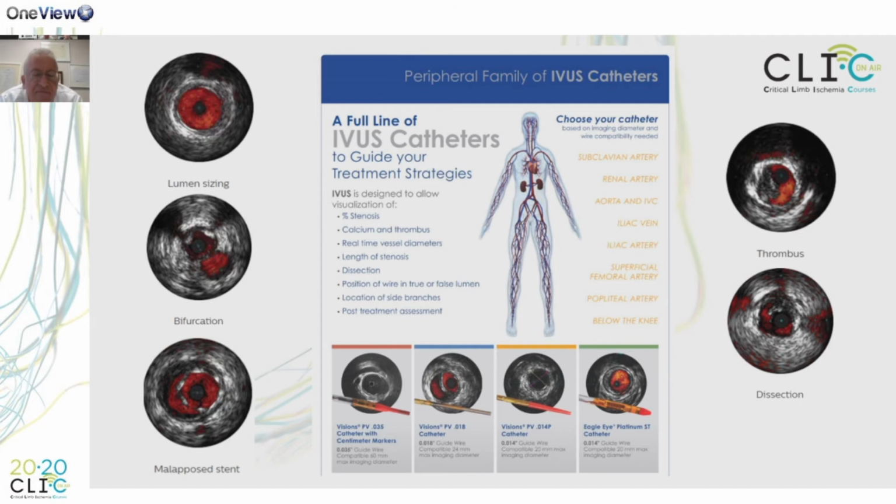The catheters are based on a solid-state design and rely on miniaturized phased array elements oriented circumferentially at the tip of the catheter. The elements receive backscattered ultrasound and the signals are routed to a computer which constitutes real-time images. The advantages of a multi-element catheter include no movable parts, no required rotation to acquire images of the vessel, and over the wire configuration.